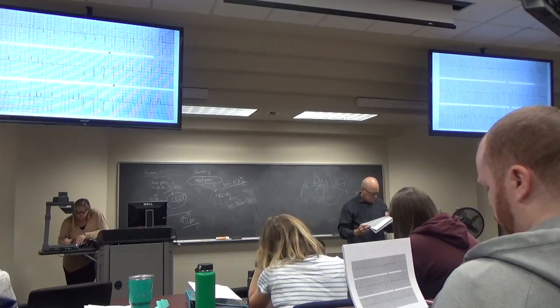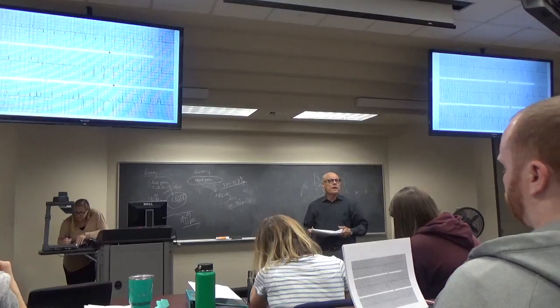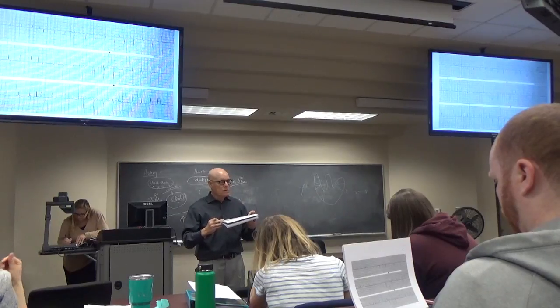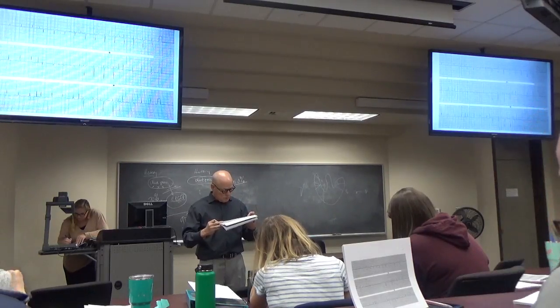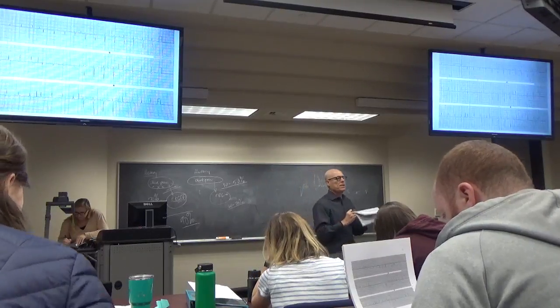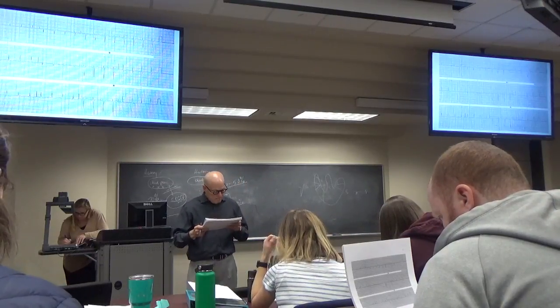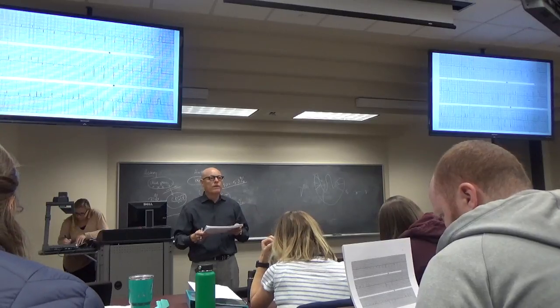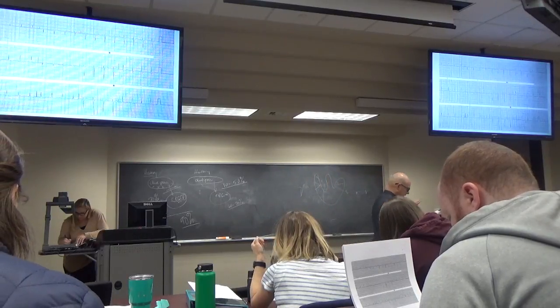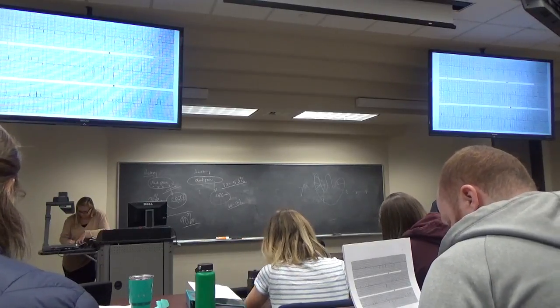Yes. And first degree. No, just kidding. Just one, two. Anybody get anything else? Yeah. I had inverted T waves in 2, 3, and aVF, and I called it age indeterminate infarct of the inferior wall. What is the definition of an infarct on the EKG? Q waves. Do you see Q waves in 2, 3, and aVF? No. Oh, yes. Maybe a tiny one in 2, but there just aren't any Q waves wide enough and deep enough to be an infarct. So this is ischemia, or primary T wave changes in the inferior leads. Anyone else write that down?